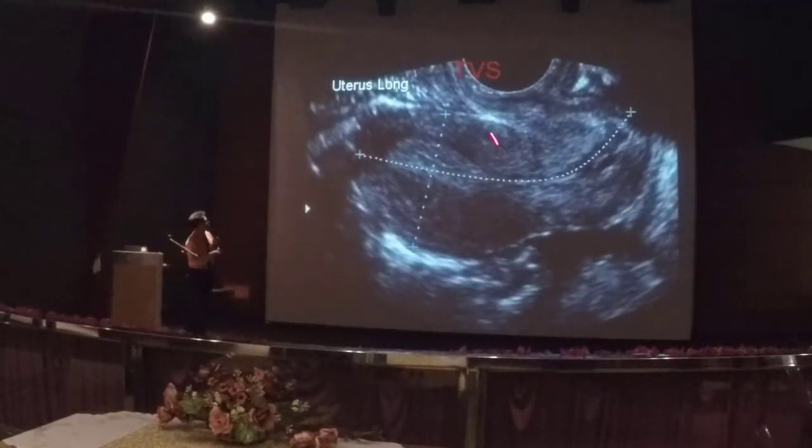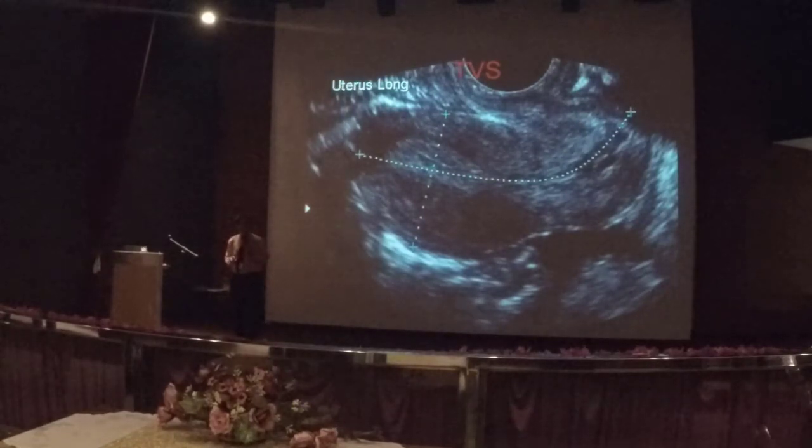Abdominal scan, this slide ada dalam picture. Kalau tengok probe dia macam ni, biasanya TVS scan. TVS scans usually dia punya frekuensi higher. Kalau kita tengok siapa yang pergi ke klinik yesterday, you can notice that if you apply the form 4 basic physics principle, the ultrasound wave ada frekuensi dia, measured in hertz kan.